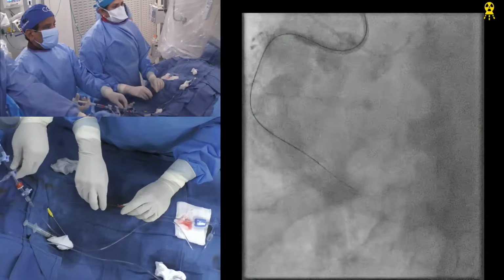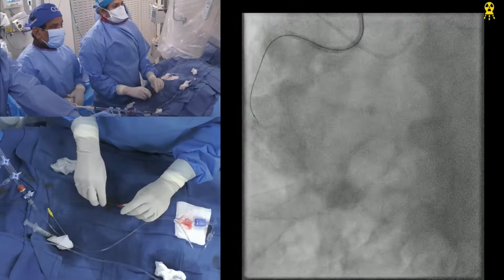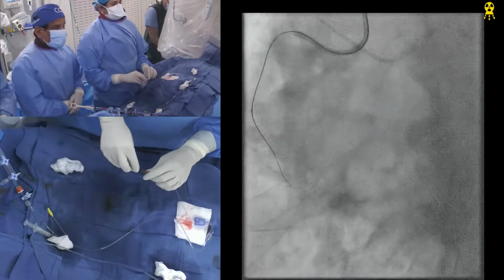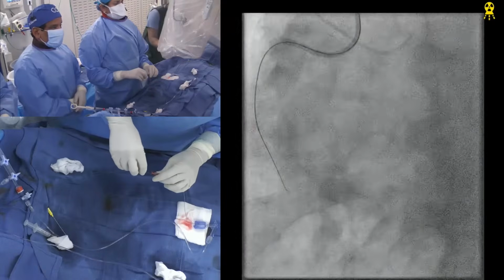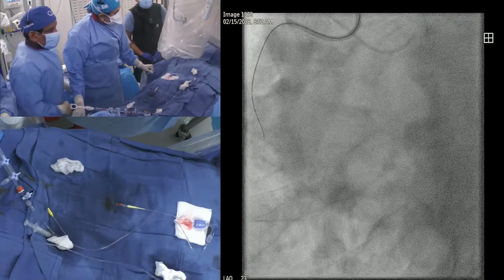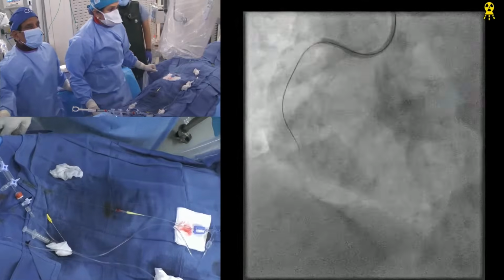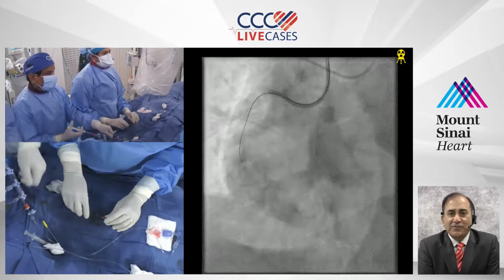So very important. Are you retrograde? Lot of PVCs. Anytime you have some PVCs, that basically means you have probably gone a little epicardial. This would be such a fascinating polling question at this stage: do people think it's time to move?